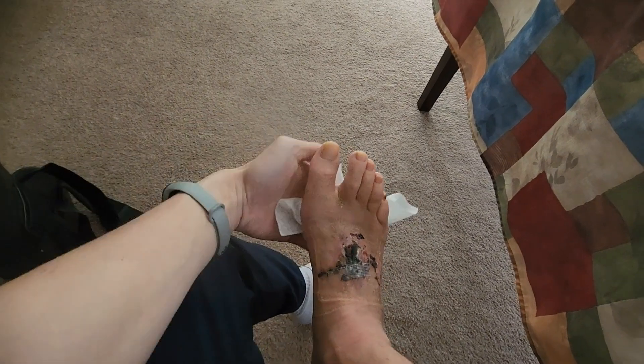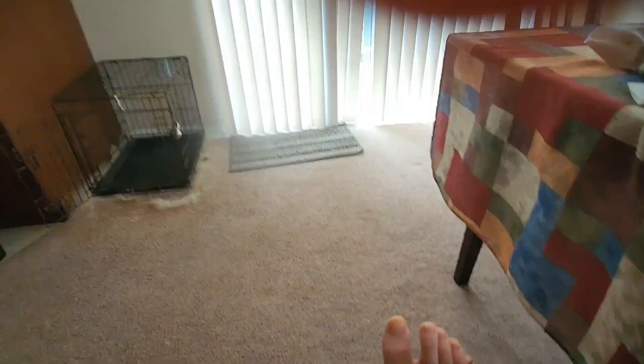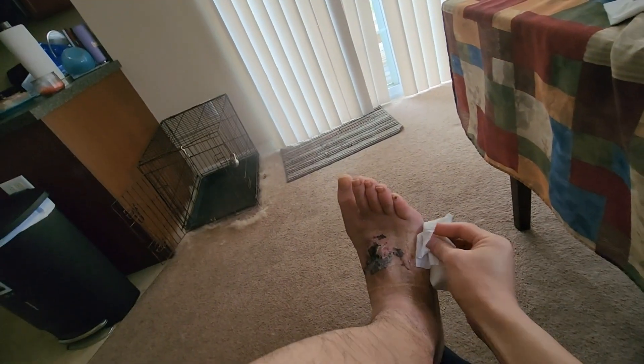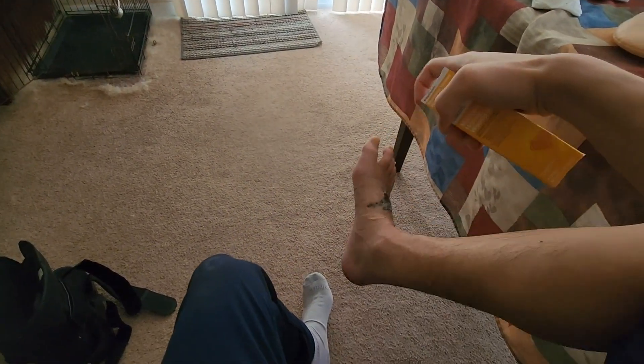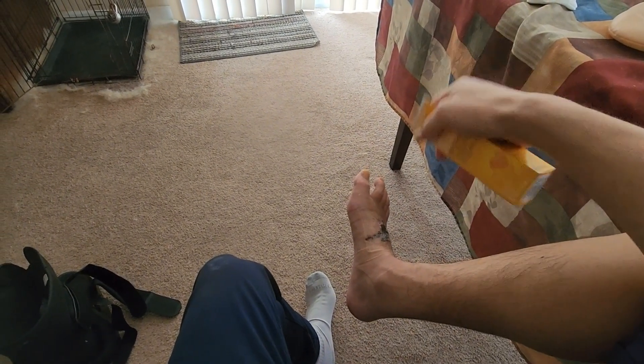I'm doing this with one hand since the camera holder isn't available. Making sure to get all parts of the foot cleaned up. Then throw the wipe in the trash. Make sure the foot is dry before applying dressings. If you're able to shower, I highly recommend using an air dryer on a warm and low setting to dry your feet. A cold and low setting also works. Drying too aggressively can compromise newly developed skin, so be careful.